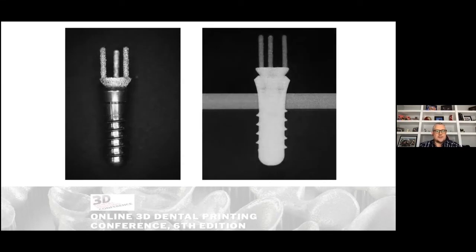How do we know it's done well? Well, that's a challenge, but it has to be per unit. And what we have here is a dental implant, and we're testing the threads just to make sure it's threading well, that it fits well, so that when we torque it, it's not going to strip.